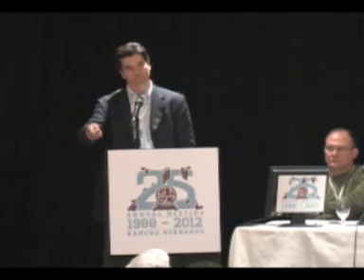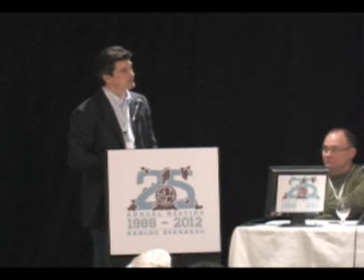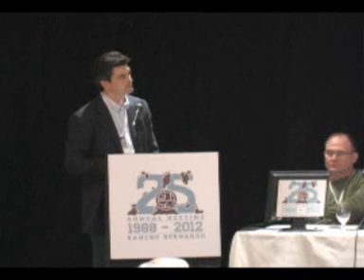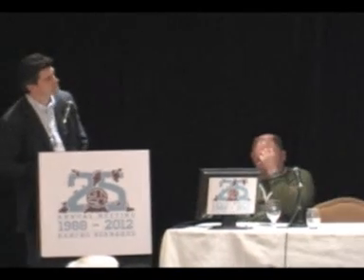And then by rotating the scope 90 degrees, as you know, you're going to start hitting the subcarinal region. This is a very small little subcarinal node right here. This was the esophagus that we were looking at over here. Then typically measure this in short axis dimension. This was pretty small, about 5 millimeters or so. And then we biopsy.